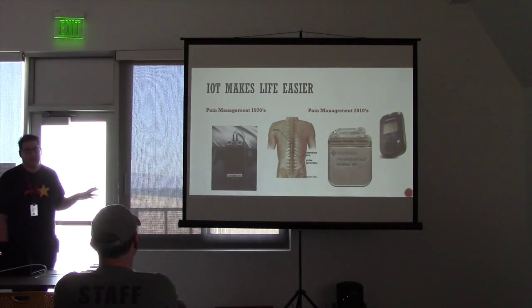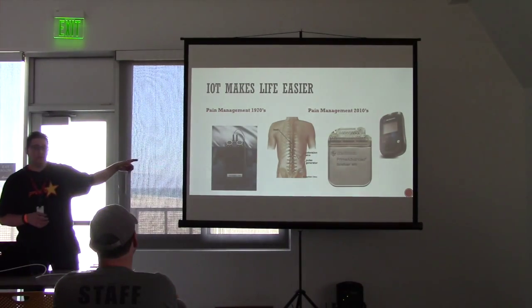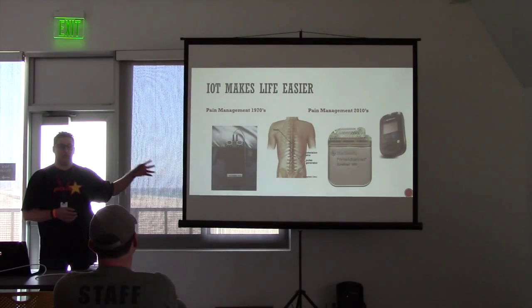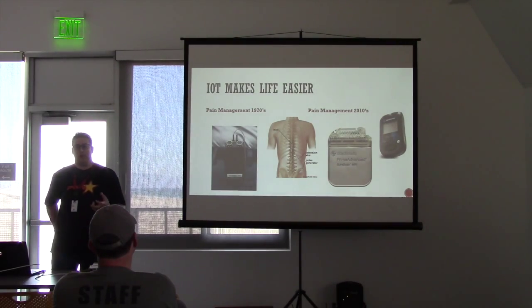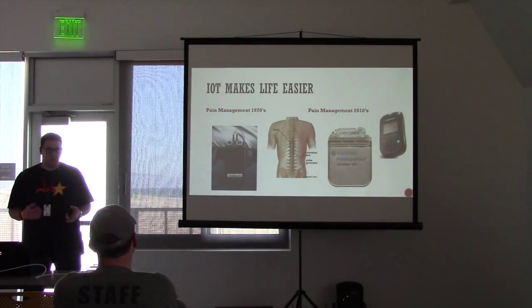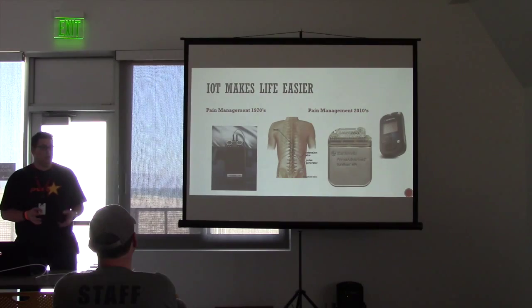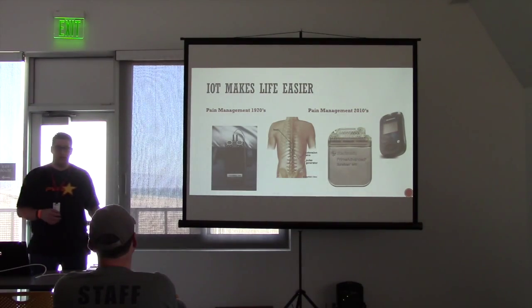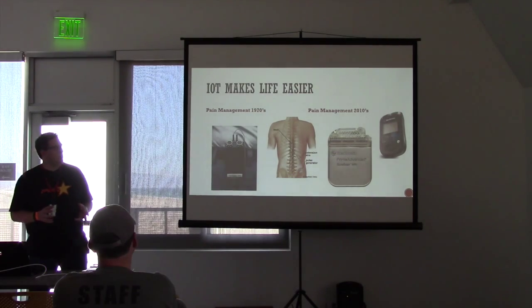So let's talk about pain management for a minute to just give some perspective. The item on the left is what a pain management device looked like in the 70s. It was a large device that had leads that went into your back. You actually had to keep it outside your body, which means you were constantly changing the device, the pad on your back, where it went into your body to make sure it didn't get infected. Very heavy to carry around, had to be recharged, not really something that was easy to use.